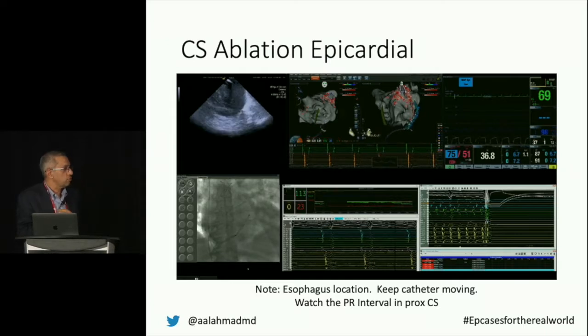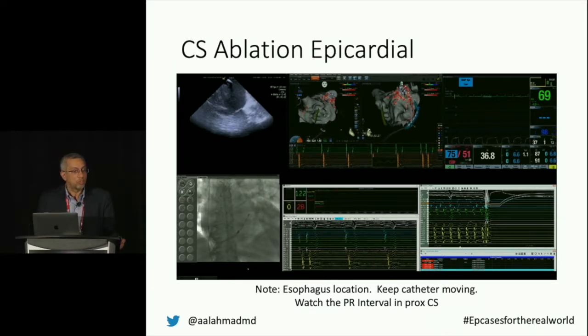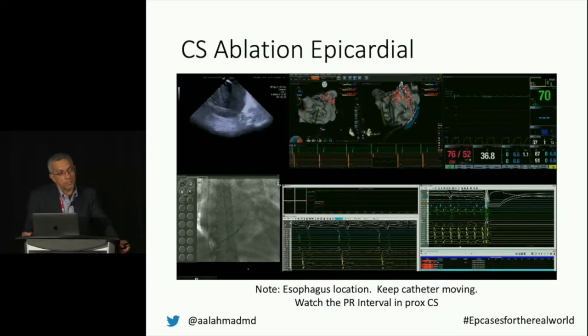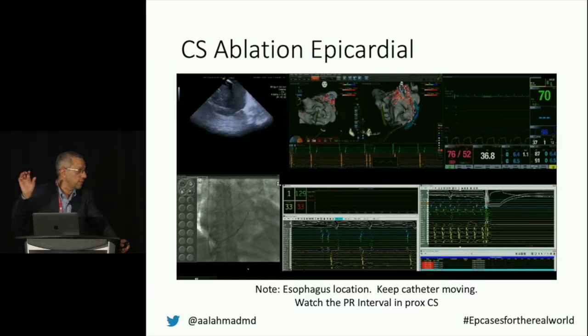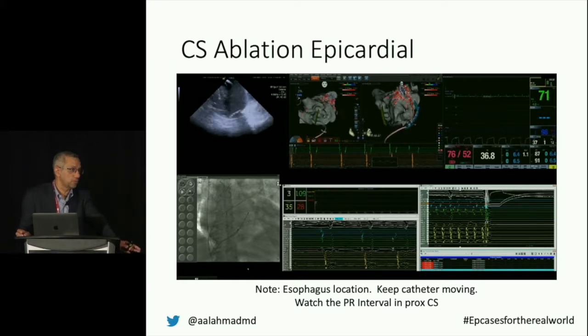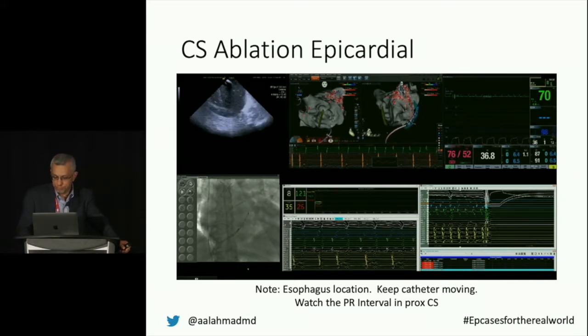Yeah. And especially if you've ablated a lot anteriorly and the only remaining connection is posterior, as you ablate inside the coronary sinus, you can isolate the appendage. And you wouldn't know that if you had withdrawn your catheter out. So if I'm ablating in the coronary sinus, I often will keep my lasso up there just to monitor for that. So if you do isolate the appendage, you want to know about it so you can direct the patient in terms of what to do.